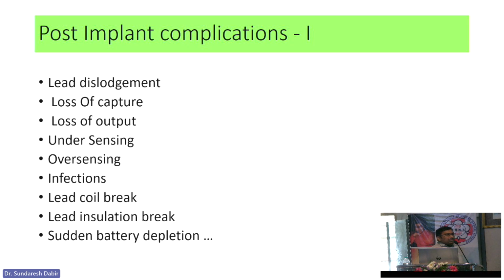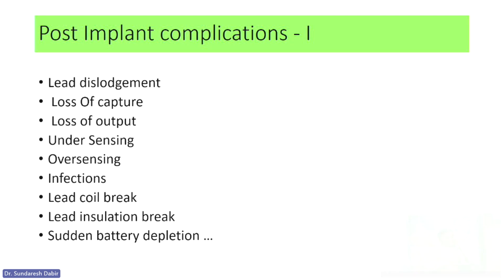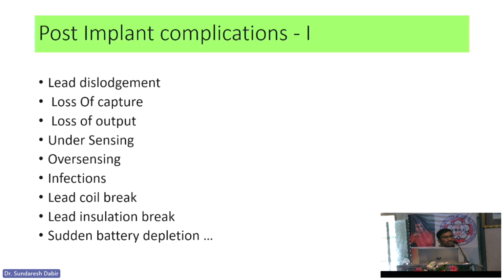So why should I choose this VOO mode during the surgery? Because when they use the cautery to cut the tissue or for coagulation, in that case we should keep VOO so the pacemaker doesn't sense the electrical stimulus and will not be inhibited. Whenever it senses the electrical cautery stimulus, it will think that there are intrinsic waves and it will inhibit. We'll see later in the ECG.